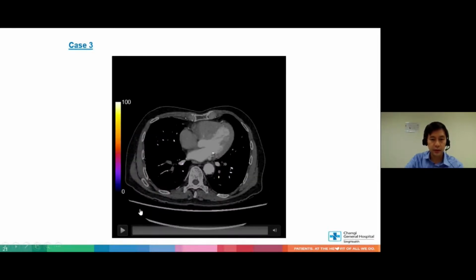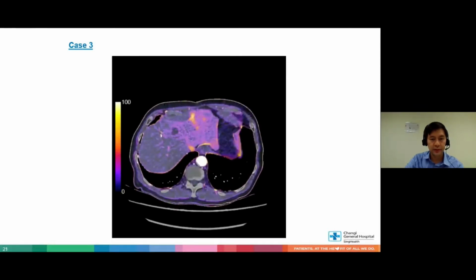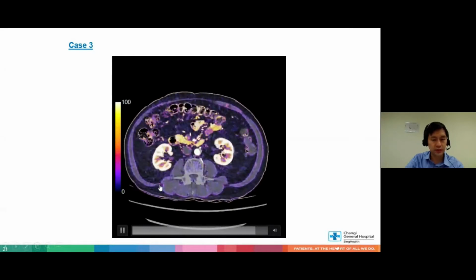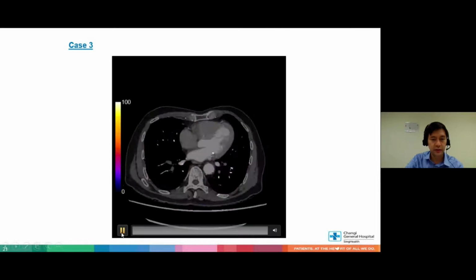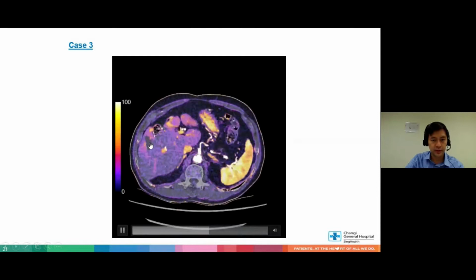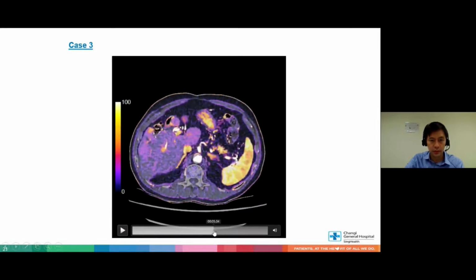Let me run the whole iodine map once to show everyone. The very same patient. Okay, there's this ablation site. I wonder, did any of you see anything? Let me try and run it again. Concentrate in segment 5, this ablation site, and there you go. I'm just going to slow this down and show this to everyone. One of us actually saw it and said, look, it looks like quite a bit of nodular enhancement in this patch just below the ablation site.